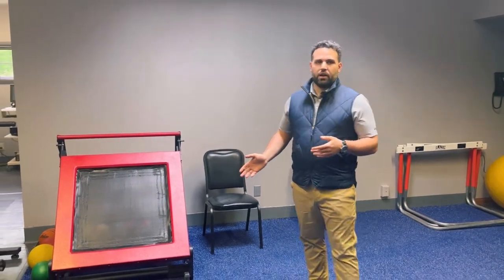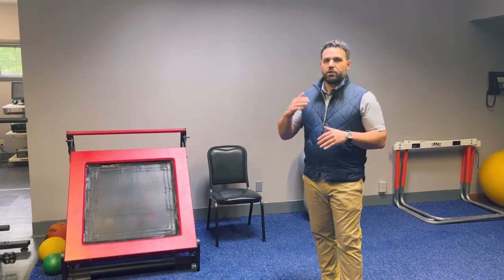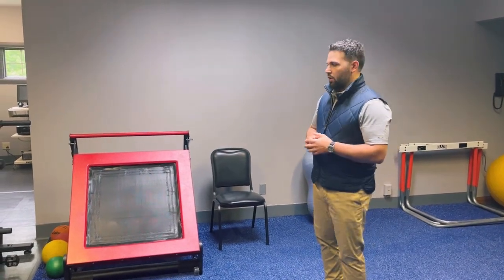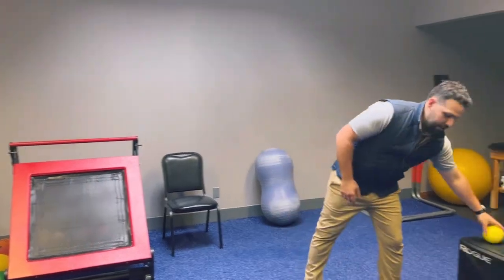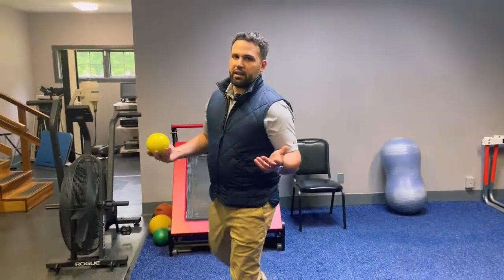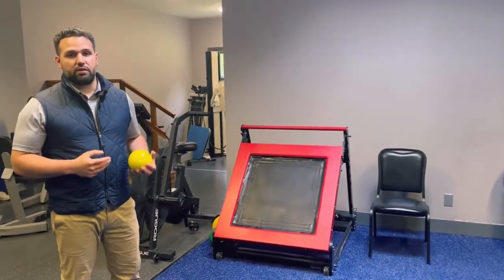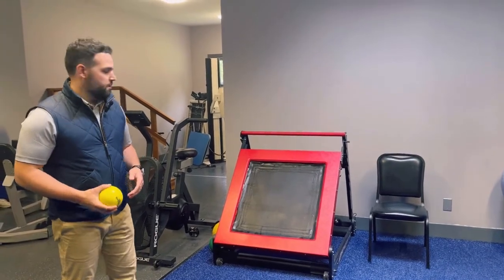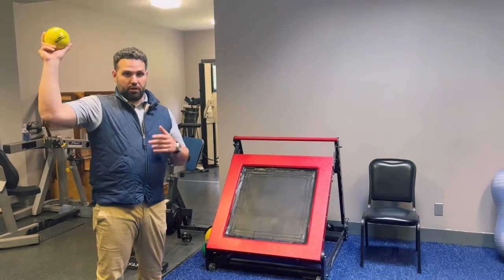The rebounder is essentially a trampoline system that can be altered to different heights. A lot of what we use it for is plyometric activities. For example, if I have a baseball player that I want to return to throwing, I might have them go through a series of different throwing motions using a weighted ball — maybe not starting with the arm up overhead.